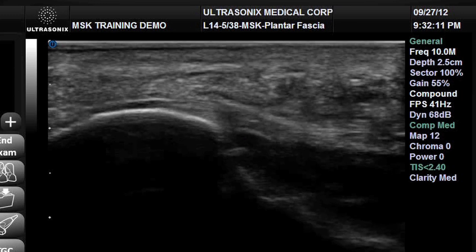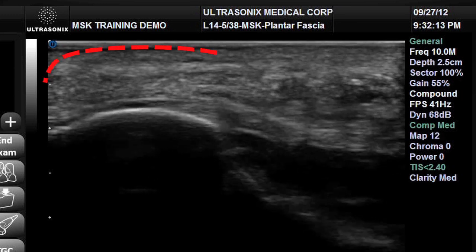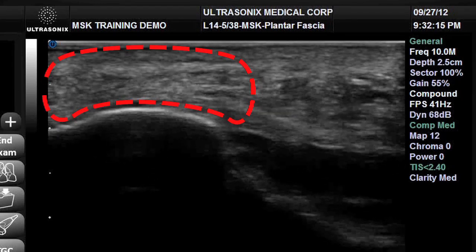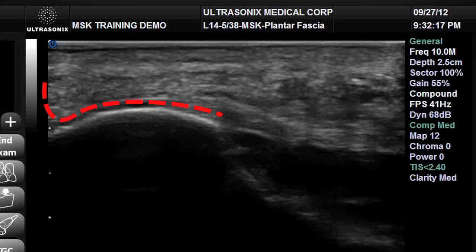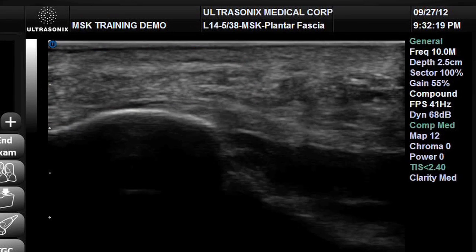Going back to the left side of the image, superficial to the plantar fascia and tapered to its attachment, is the hyperechoic mixed echoes of the heel pad.